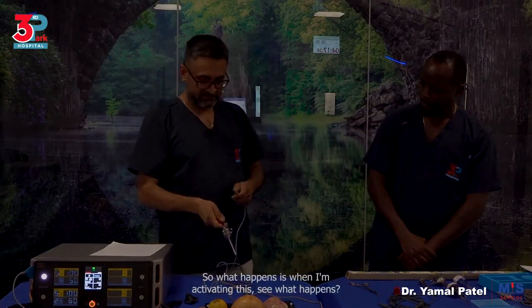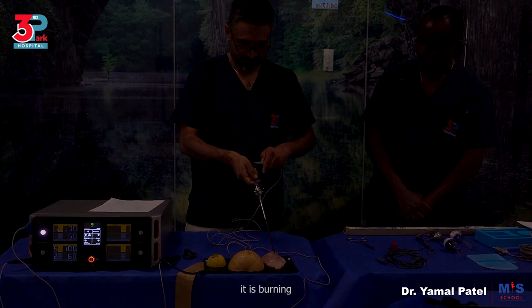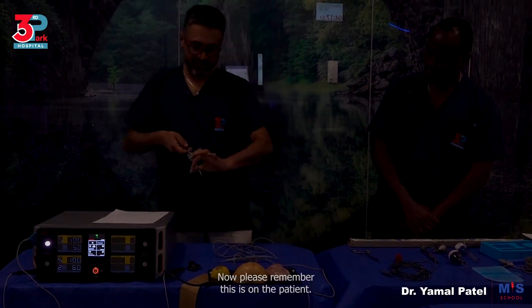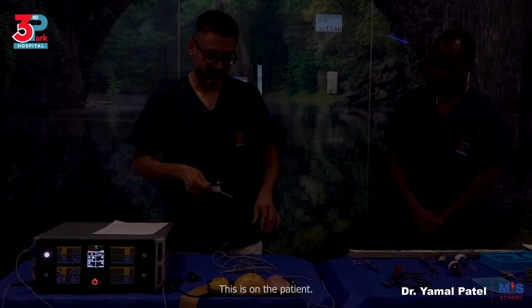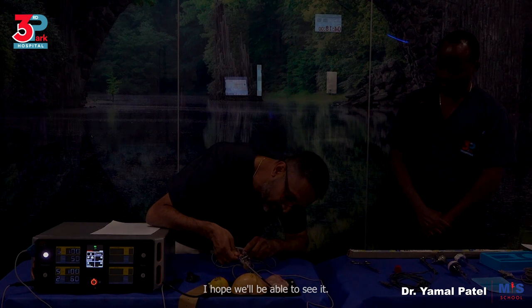So what happens is when I'm activating this, see what happens. It is burning the tissue where you want, right? That's all we are doing. Now, please remember, this is on the patient. This is on the patient. Now, see what I'm doing here, all right? Now, I want you to see closely. I hope you will be able to see it.